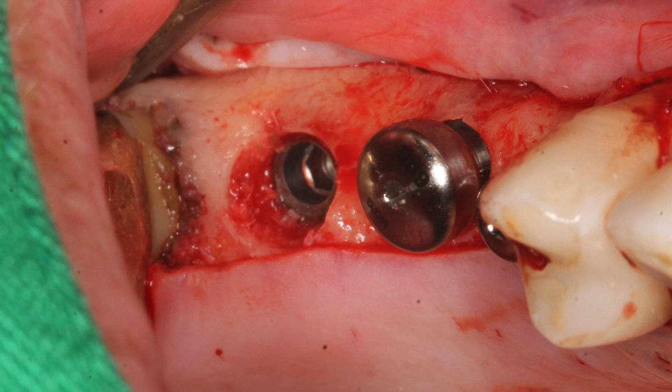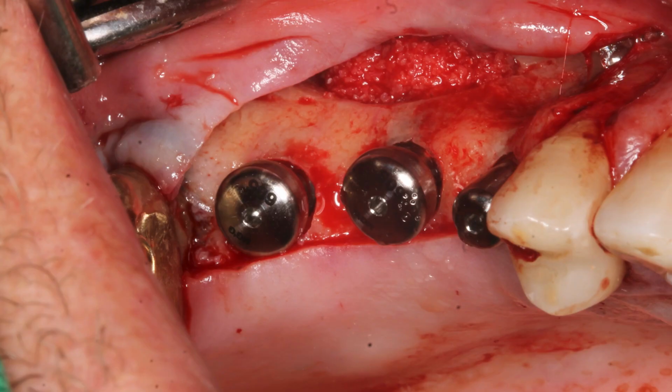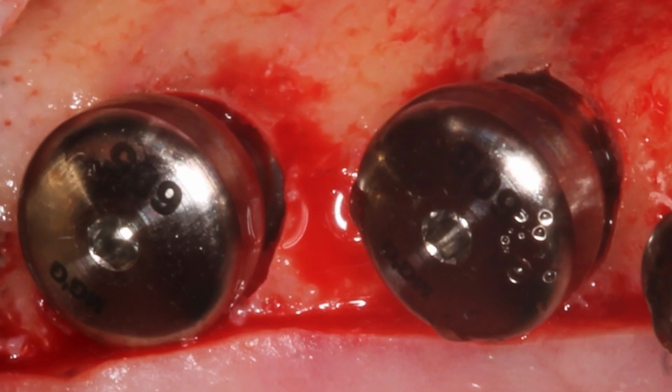So now, after the profiling, we are truly able to place the healing abutments exactly as we prescribe. And when we look at the higher power view, you might note roughly about 1 millimeter or so of circumferential bony defect. If this was classical periodontal disease, you might call that a moat defect or circumferential defect. This is not a defect because this is actually the biological space that is necessary.